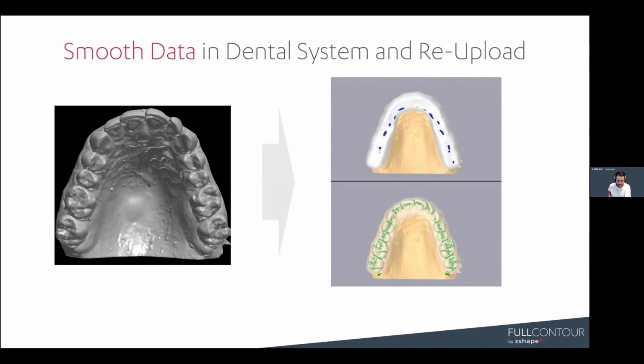Awesome, Cole. Thank you. And you guys here on the webinar today, we're here to support you. So if you have any cases like this that go crazy, we'd love for you to email us the scan, email us the screenshots, and we'll dive into it, go into root cause and see what happened and how we can solve those issues. So that's pretty much it for Automate Nightguard. Super excited to share all that with you.